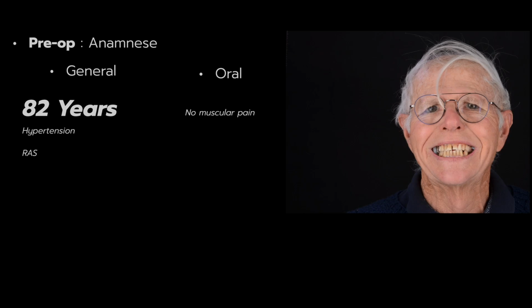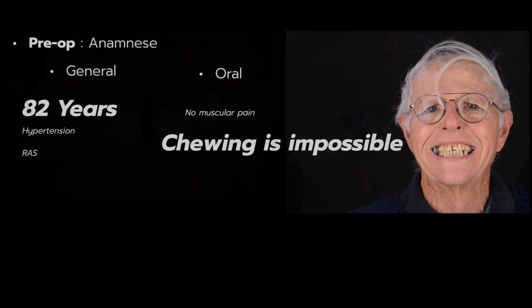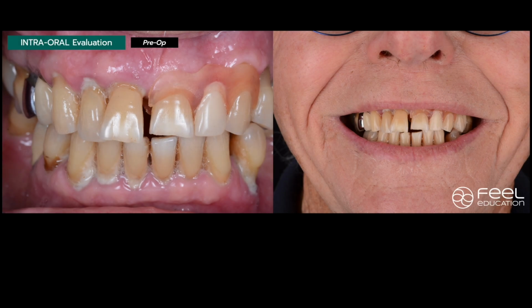So what would you do for this person? What would you do for your grandfather? Because he's 82 years old, and we have to find a solution so that he can chew, just chewing. There is no major aesthetic outcome here, but still he is happy to live and would like to have a good smile, and here is his situation at the first consultation.